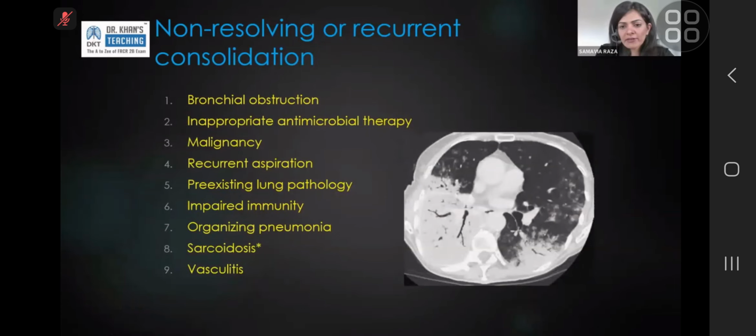Okay, so coming back to the next point that links in with the importance of follow-up is non-resolving or recurrent consolidation. Most of you already know the practice in follow-up. For those who don't, or don't realize the importance of it, I hope you will learn the importance of it today. The issue with non-resolving and recurrent consolidation is you're trying to exclude underlying pathology causing that.